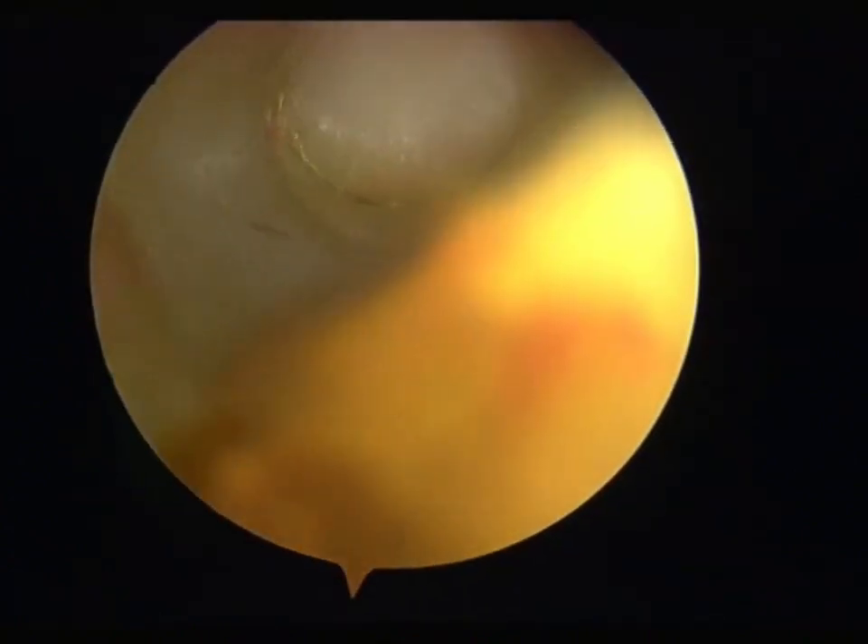This video describes the process of MACI treatment for joint cartilage injury. First, enter the patient's body through an arthroscopy to locate the area of joint cartilage defect.